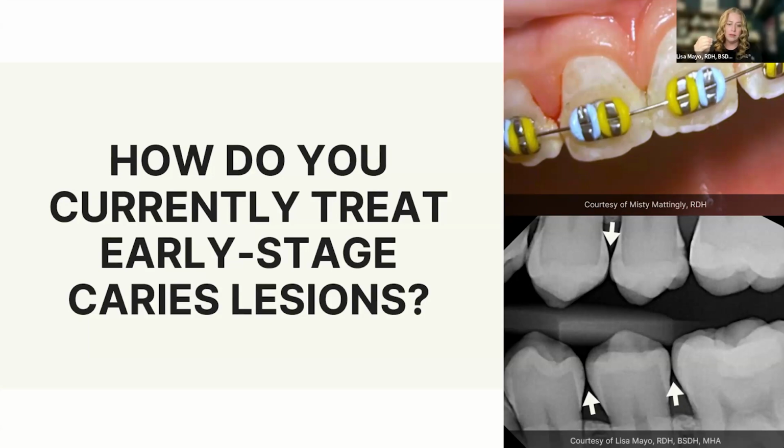The problem with these two situations is that these patients have caries. And by the time a dental caries is going to pop on an x-ray, a two-dimensional picture of a three-dimensional object, you've got a pretty significant amount of demineralization. In a Cochrane review, they said anywhere between 30 to 40% of demineralization into the enamel has occurred by the time we even catch it on an x-ray.